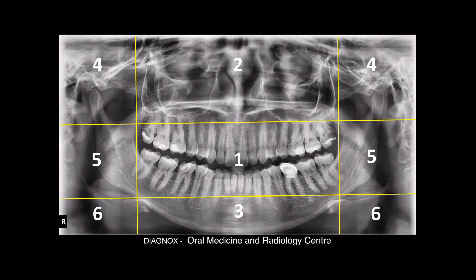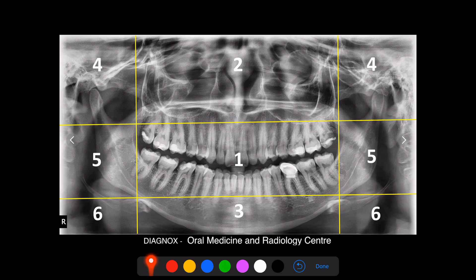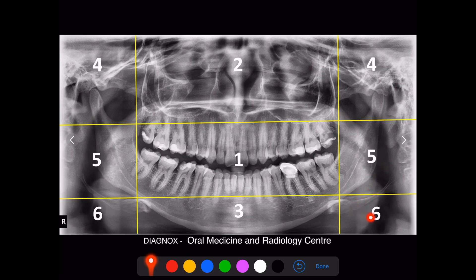For example, as you can see in this picture, zone one includes your complete dentition and zone two includes your maxillary sinus and nasal cavity. Zone three tells about the symphysis as well as the parasymphysis region. Zone four tells about the TMJ and its surrounding structures. Zone five includes the ramus as well as the angle of the mandible. Zone six tells about the hyoid bone as well as a part of the submandibular gland region.